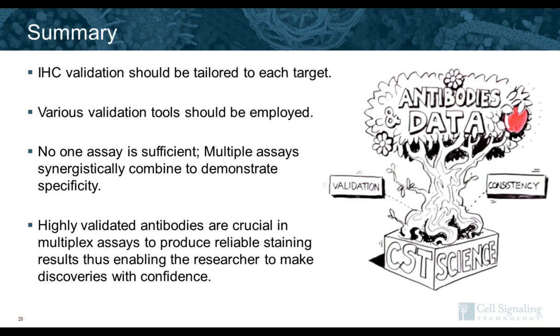In that case, it's not necessarily just that you plug in the new antibody, but my suggestion would be to test the new antibody in the panel where you plan, in the order you plan to place it. And then if those results are satisfactory, then great. If not, then the panel will likely require a bit more optimization and possibly changing the order of staining and which OPAL fluorophores are used for each antibody.